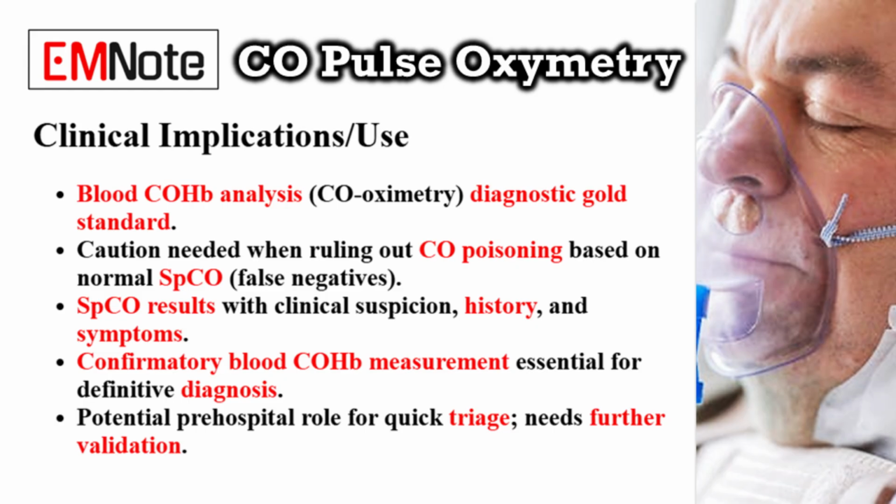SpCO's rapid and non-invasive nature suggests a potential role in the pre-hospital setting. It may aid in quickly identifying and triaging patients suspected of carbon monoxide poisoning, facilitating timely transport to specialized centers. However, this pre-hospital application requires further validation through larger prospective studies.